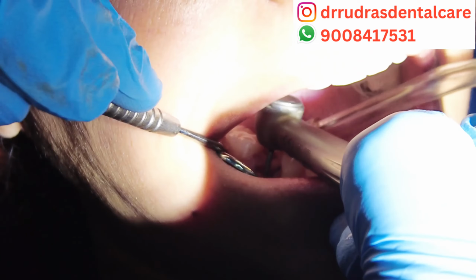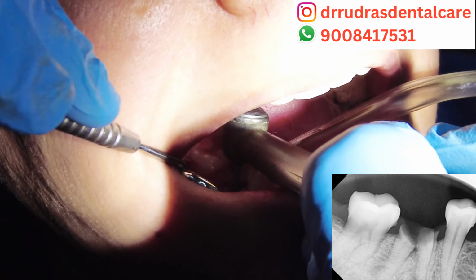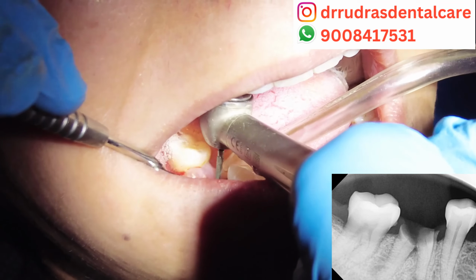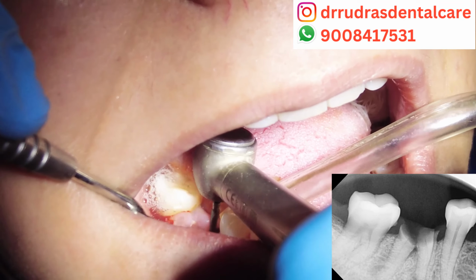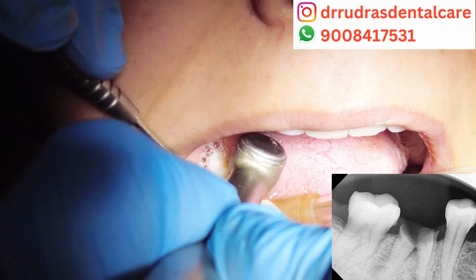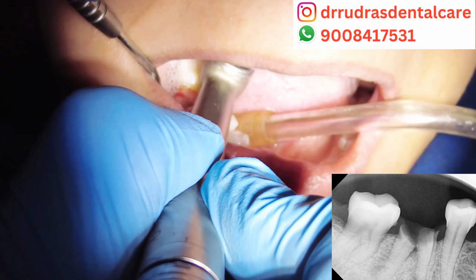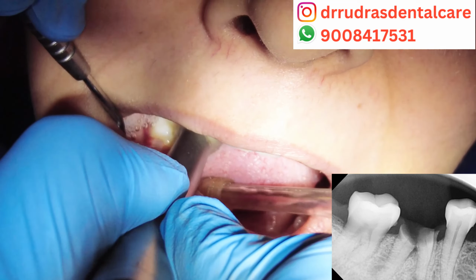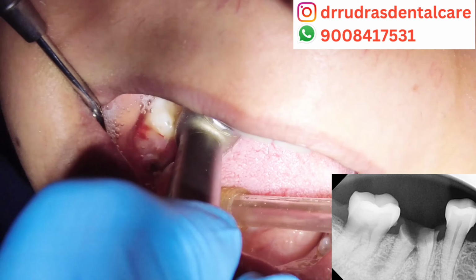Now the first part and the first tooth that was extracted, we had extracted the first half of the root, as in one half of the root, and now in order for us to take out the other half which is submerged in the bone, we are creating a purchase point. Now a purchase point is a point that is created by a drill, and we can therefore use that purchase point as a fulcrum or as a wedge, and where we can wedge the instrument and we can use a lever principle so that we can use the elevator to luxate the tooth. By luxating, it means we are moving the tooth to take the tooth out easily.